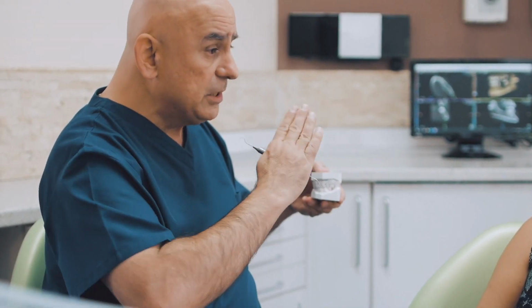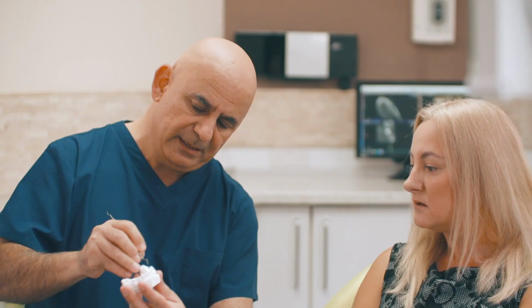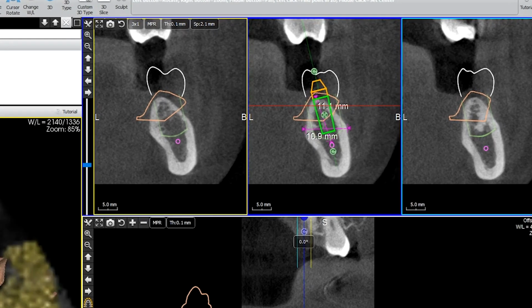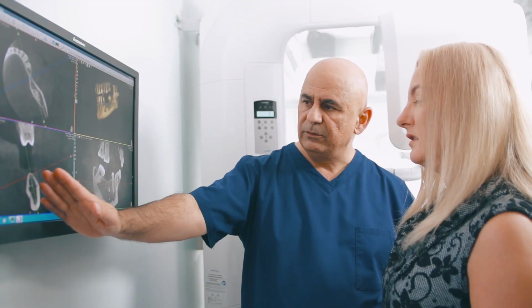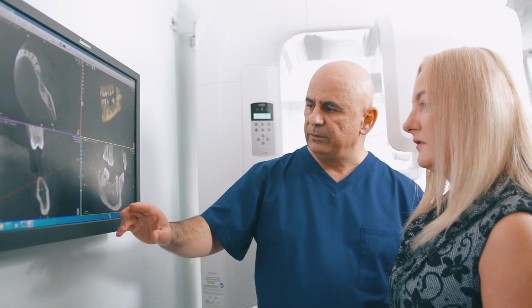So after treatment planning, of course, you want to communicate with your patients. As we know, not everybody thinks the same. So before, we had cases where patients would decline purely because they couldn't understand or visualize what we were trying to do. And now, with the help of the Acteon imaging suite, that's something of the past, because now they see the scan. A lot of times, patients will mention that actually this turned out exactly the way you said.